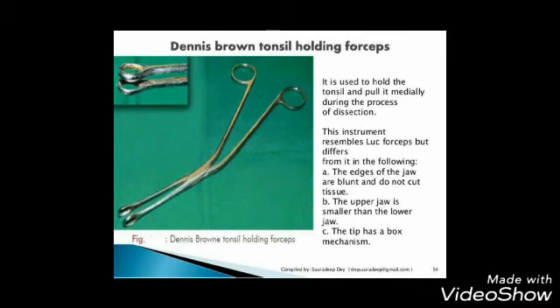It is Dennis Brown tonsil holding forceps, used to hold the tonsil and pull it medially during the process of dissection.